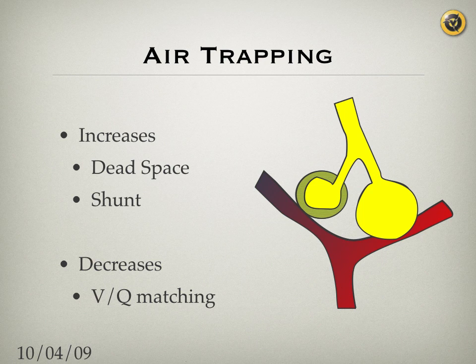And this is a very important point. Sometimes you have patients who are in ARDS and are requiring a large amount of PEEP, say 15 or 20, and now they are on this for a few days and they are starting to get better. When they get better, you have more normal alveoli. If you look at the x-ray, it's getting better.